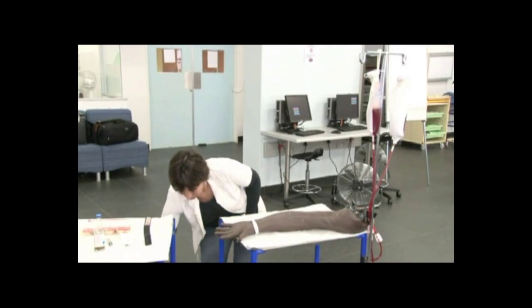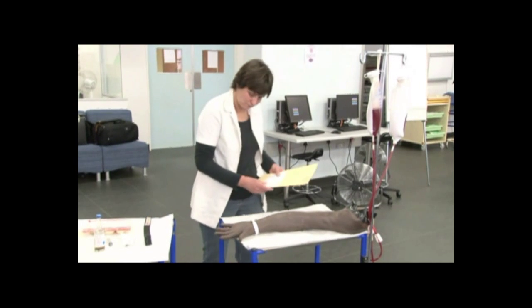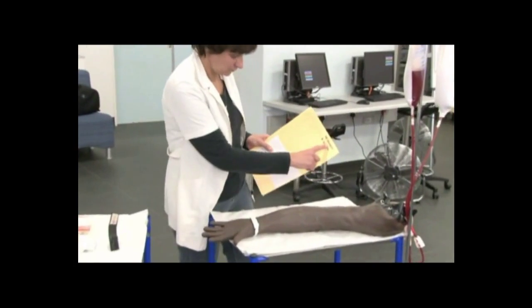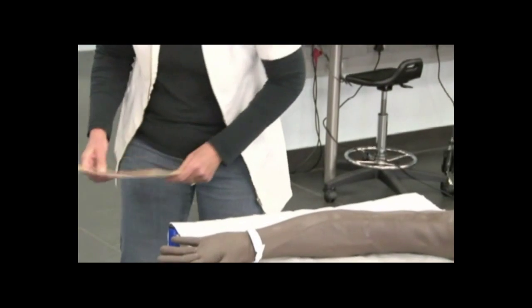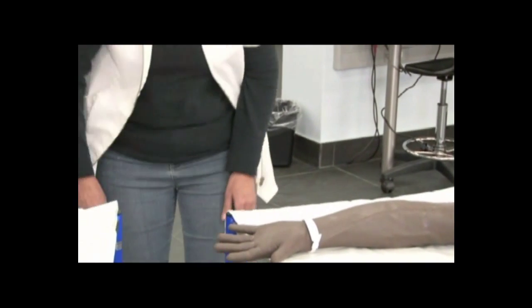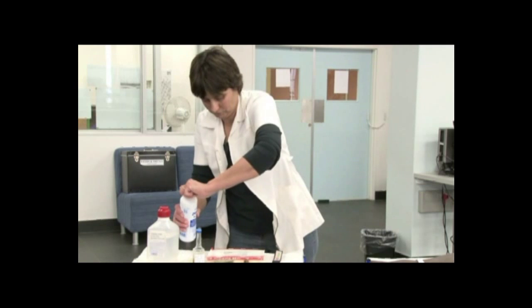Verify the patient's identity. Ask the patient for his or her name and check the armband. Look on the wall above the bed or in the patient's notes to confirm their identity. Inform the patient of your intentions and explain the procedure. Always obtain verbal consent. Roll up your sleeves and degerm your hands.